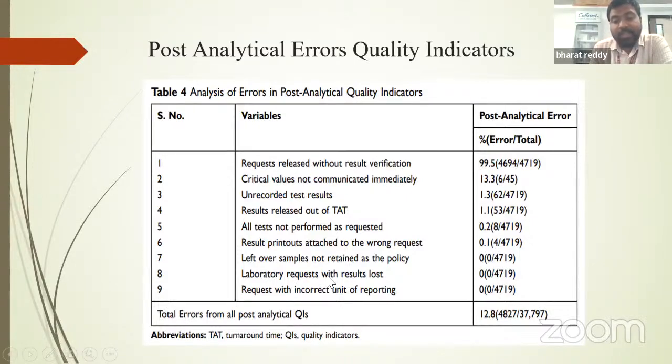Laboratory requests with results lost. Request with incorrect unit of reporting. This is also very important. We are performing in milligrams, and we report it as milliequivalents per liter. Like that, these are also erroneous reports.